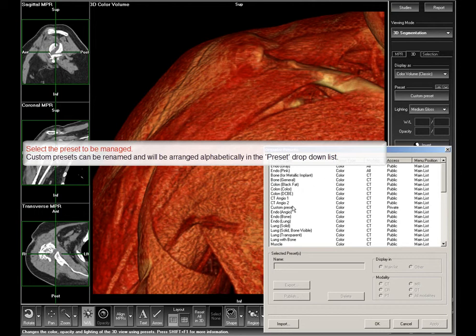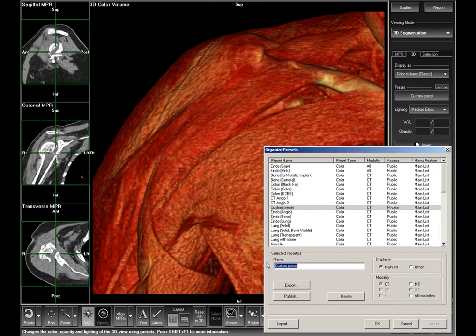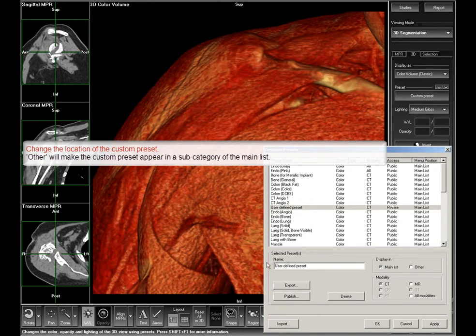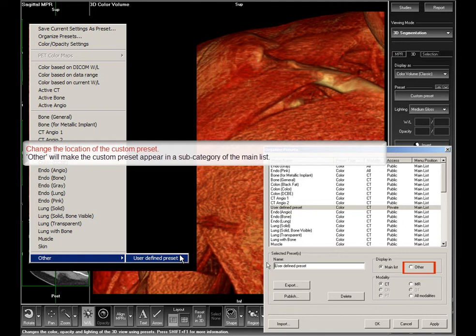Select the preset you want to manage. In the name box, you can rename the selected preset if necessary. Custom presets will be arranged alphabetically in the preset drop-down list. By choosing Display in main list or other, you can define whether the preset will appear at the bottom of the presets list or in the other subcategory of the presets list.